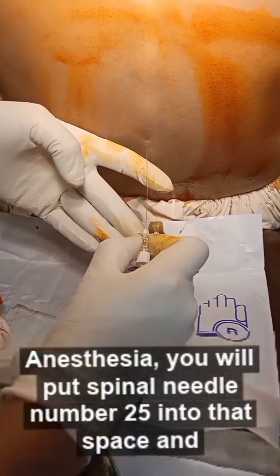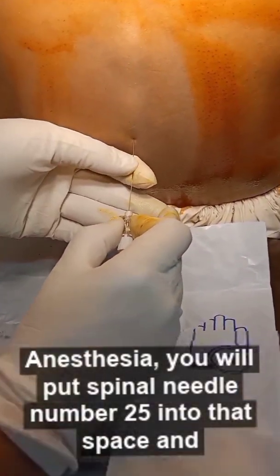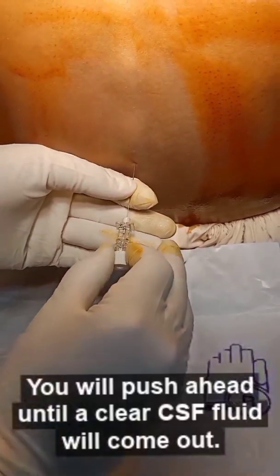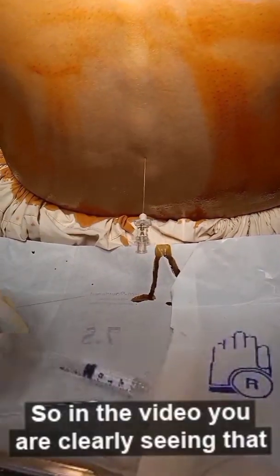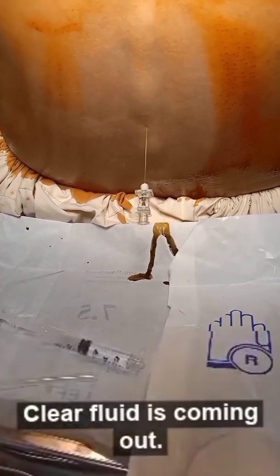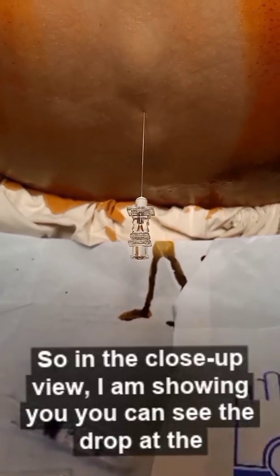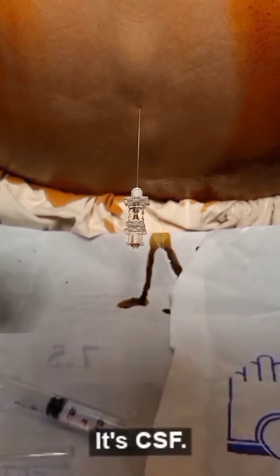Now you will put spinal needle number 25 into that space and push ahead until a clear CSF fluid comes out and dribbles out. In the video, you can clearly see that clear fluid is coming out. In the close-up view, you can see the drop at the end of this spinal needle — it is crystal clear CSF.